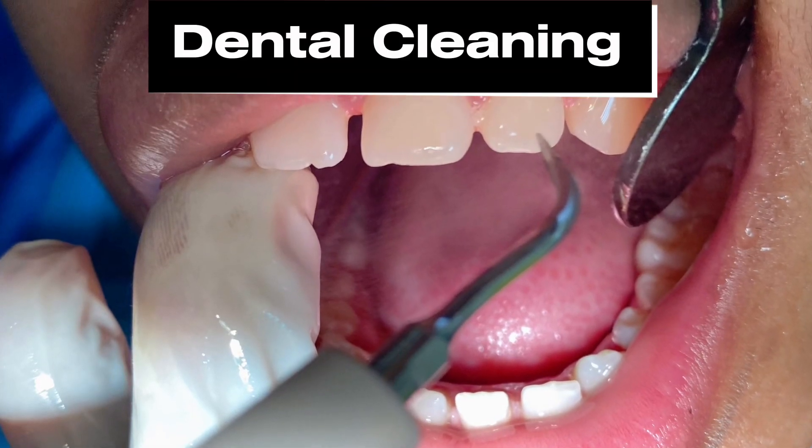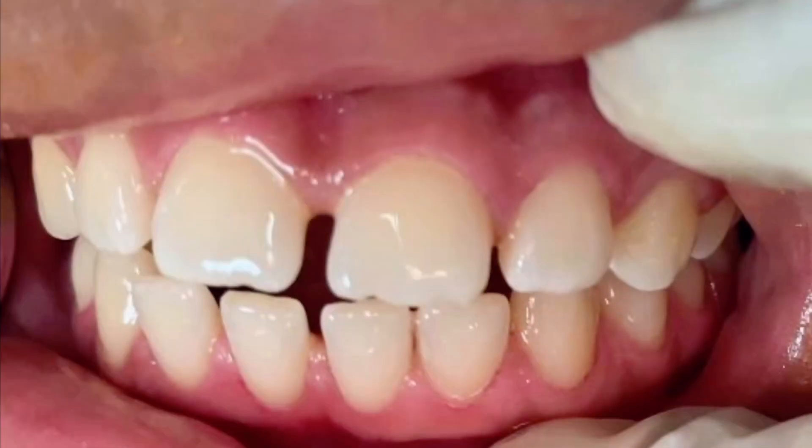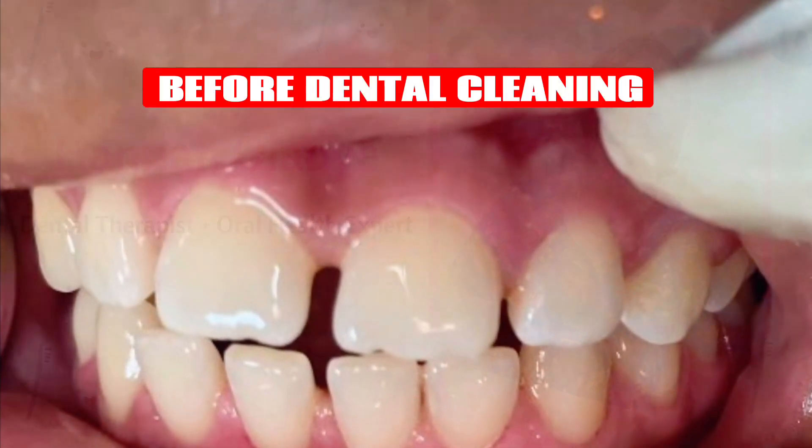In today's video, I'll be showing you routine dental cleaning, also known as scaling and polishing, with a close-up view of the mouth, removing plaque, stains, and tartar.